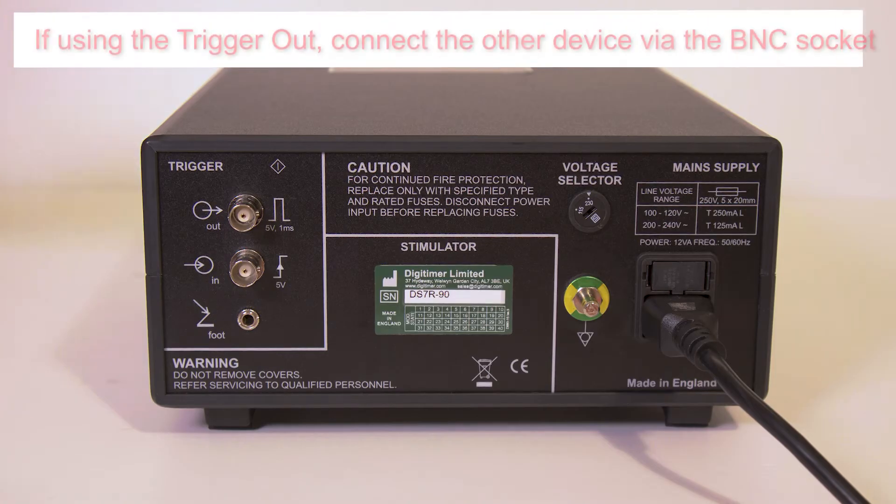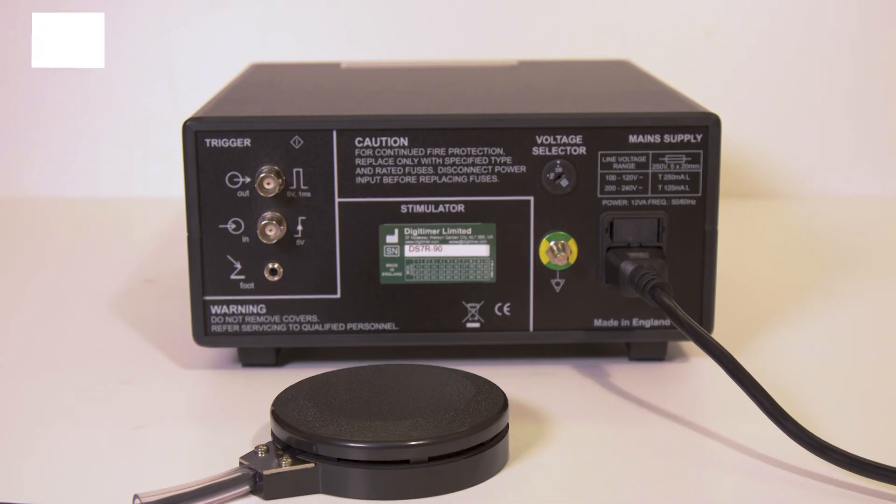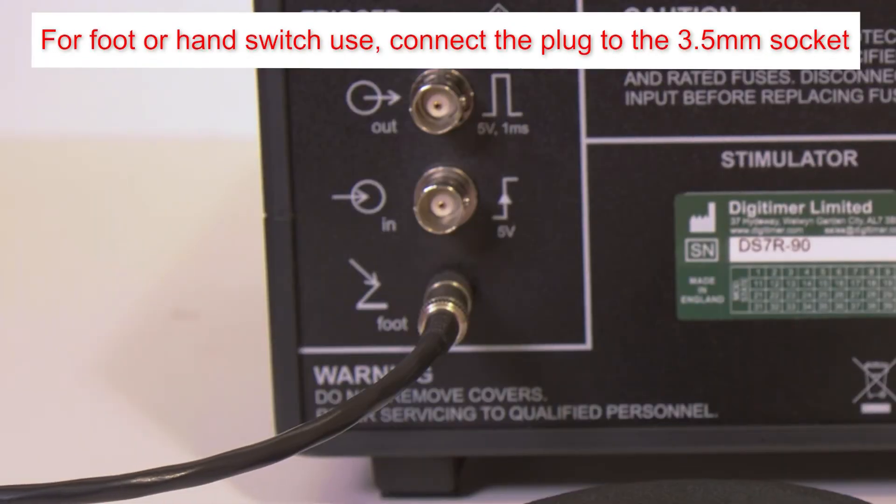If a sync output or event marker is required, connect the other device to the trigger out socket using a BNC cable. For foot or hand switch users, connect the plug to the 3.5mm foot switch socket.